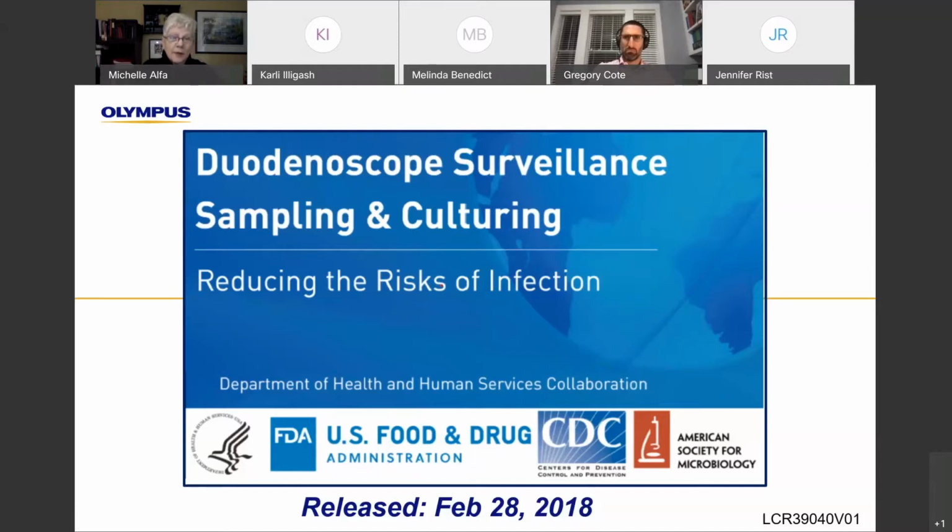Yes, the gram-negative bacilli are probably the ones most involved with outbreaks, but there are other high concern organisms that are gram-positive that would obviously not be detected by the rapid gram-negative test. And the other thing is that high CFUs in the FDA protocol are a concern and considered actionable, but these would not be detected by the rapid overnight gram-negative culture method either.